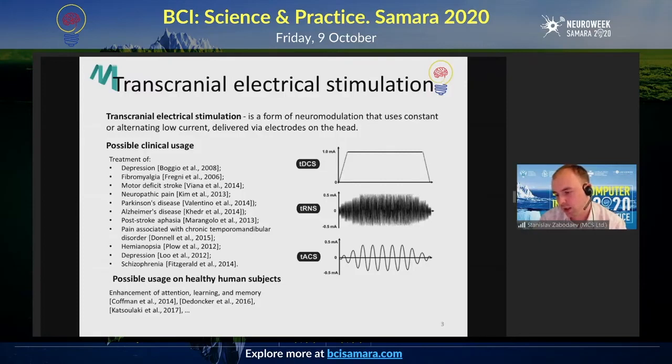Navigational TMS provided an increase in the development of TMS itself, but the coils that are used in TMS are rather large, therefore it is a bit harder to aim the magnetic fields to target a certain brain location that needs stimulation. There is a certain gradient which is quite extensive, so we need to understand that TMS can be used to stimulate not just a certain brain area, but also all of the adjacent areas.